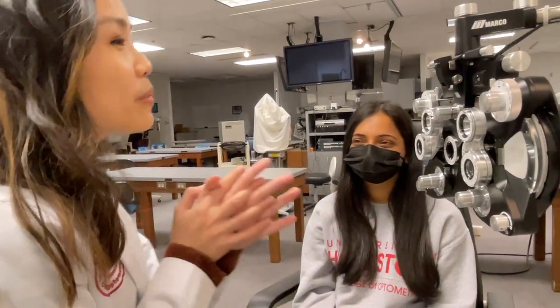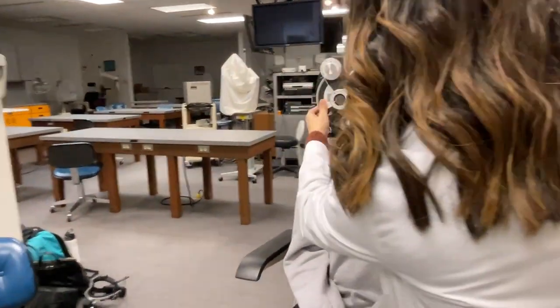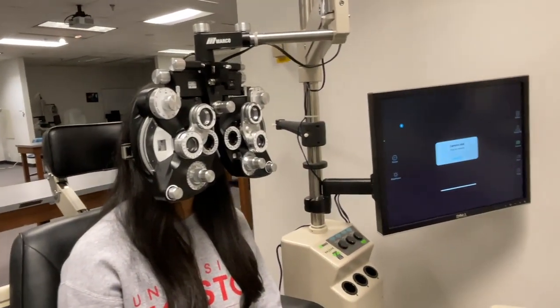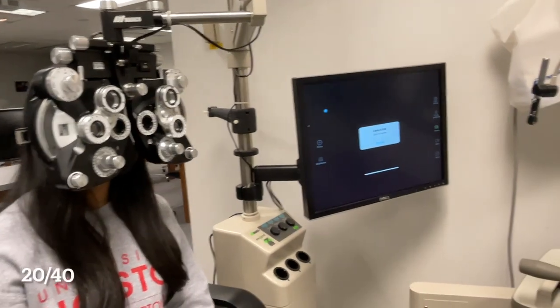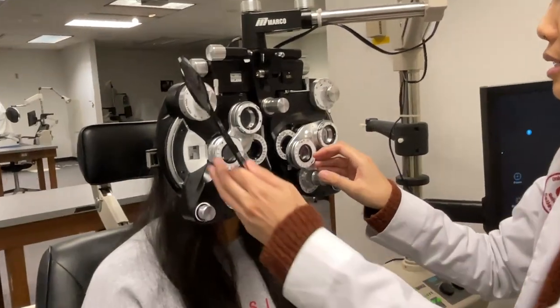Awesome. All right, so now I'm going to see how well your eyes work together as a team and how they're aligned. Have you come forward one more time? Is that comfortable right there for you? Yes. Okay, so now I'm gonna turn the chart back to a 20/40. And I'm just gonna occlude one of your eyes.